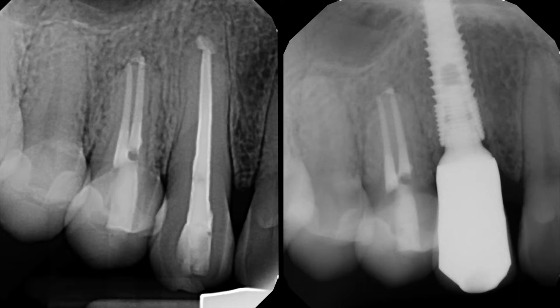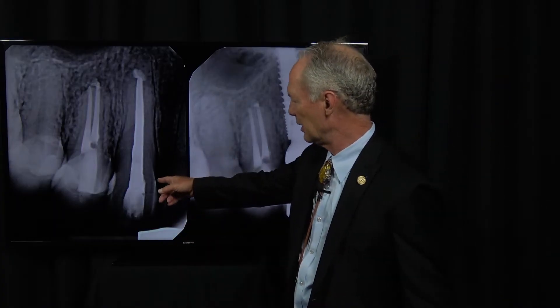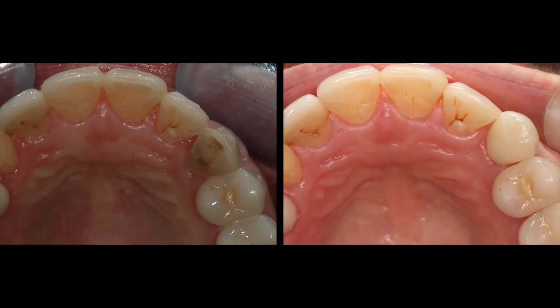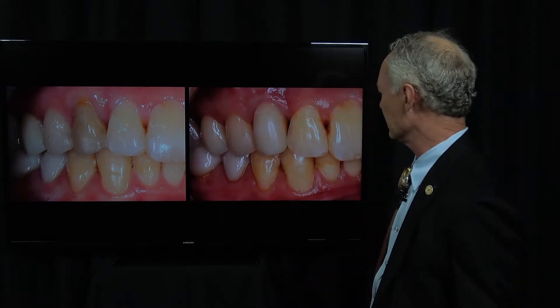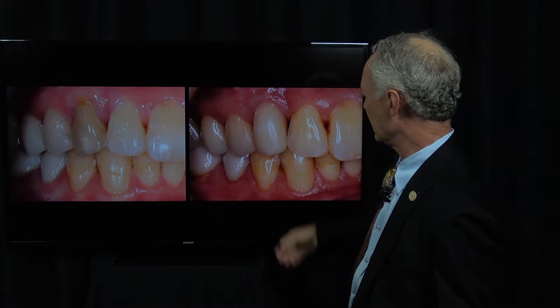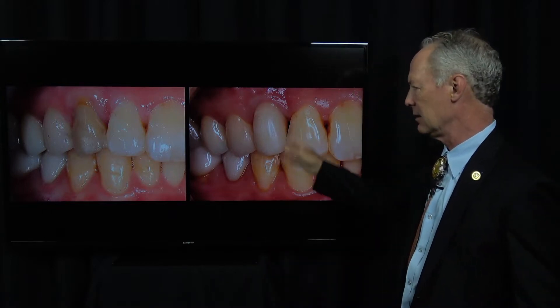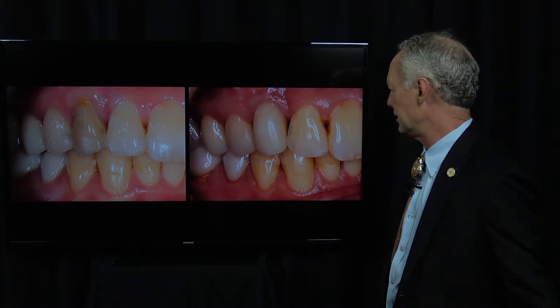This is a before and after. This cuspid had endodontics and an apicoectomy — just about everything. Here is the implant with the screw-retained abutment and crown. We'll be talking about seating the screw-retained implant, abutment, and crown in this episode.